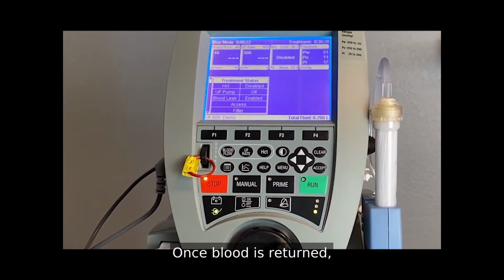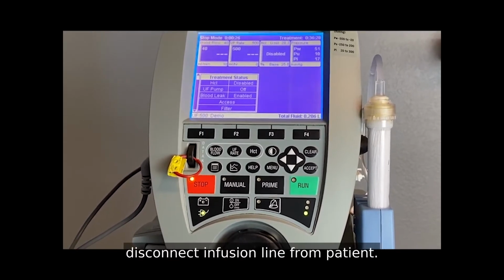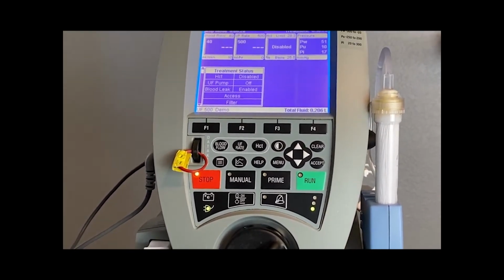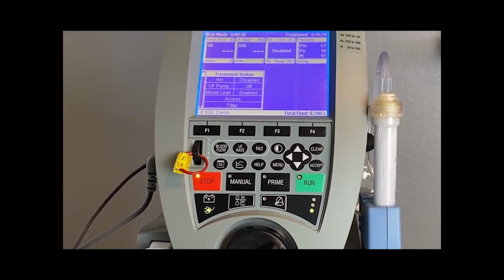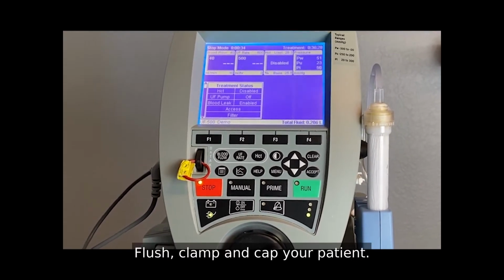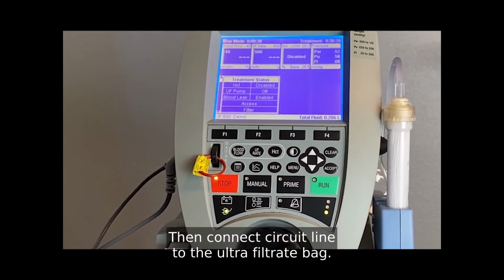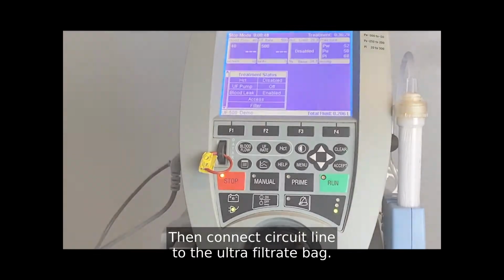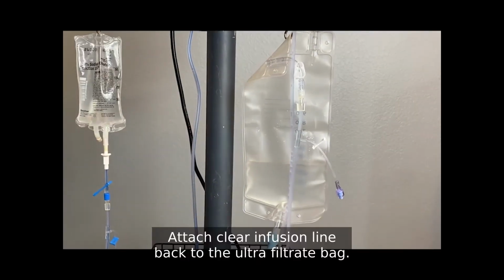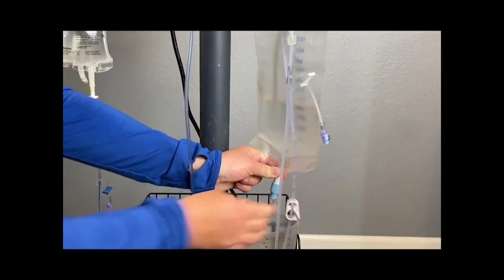Once blood is returned, disconnect infusion line from patient. Flush, clamp, and cap your patient. Then connect circuit line to the ultrafiltrate bag. Attach clear infusion line back to the ultrafiltrate bag.